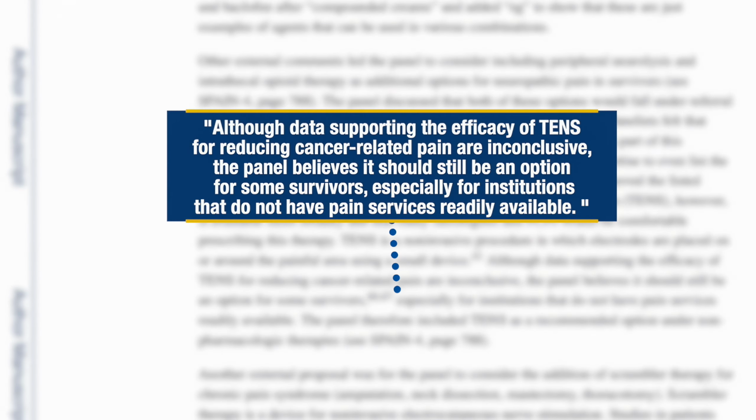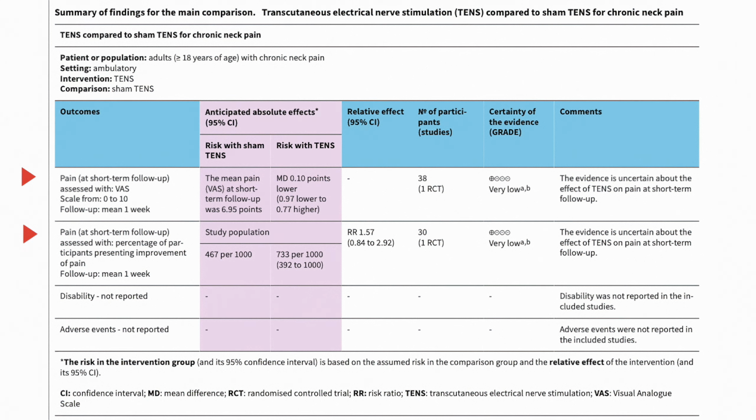For non-radicular neck pain, a systematic review including 7 trials found no definitive conclusions could be drawn due to the heterogeneity in study interventions and measured outcomes. Even when the authors only included the 2 trials comparing TENS with placebo in their analysis, there was very low certainty evidence for similar short-term pain outcomes. Again, this is just a brief summary of the research, and new evidence may emerge.